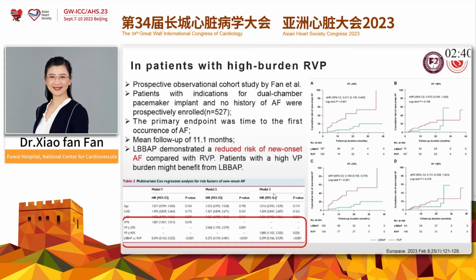That also means even in patients without heart failure, RVP could increase the risk of atrial fibrillation, and the LBBAP could reduce the risk of atrial fibrillation.